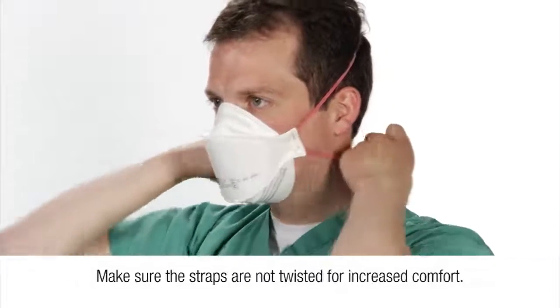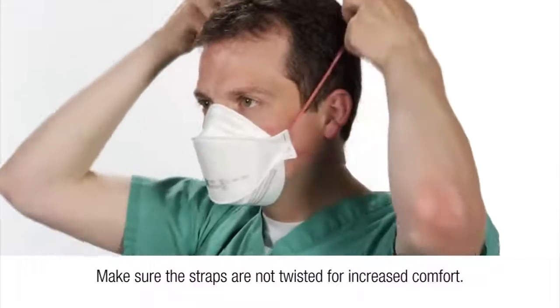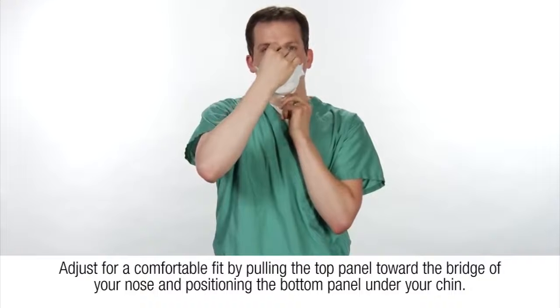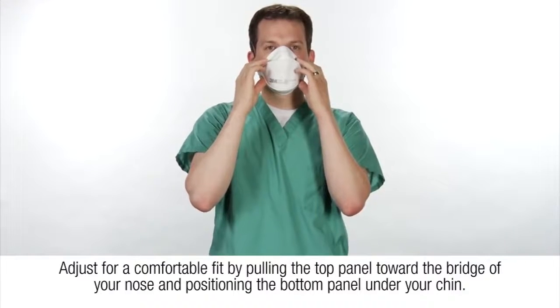Make sure the straps are not twisted for increased comfort. Adjust for a comfortable fit by pulling the top panel toward the bridge of your nose and positioning the bottom panel under your chin.